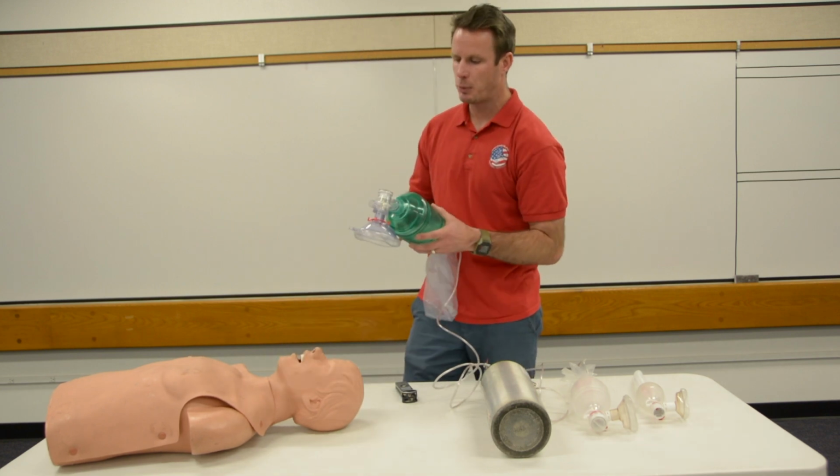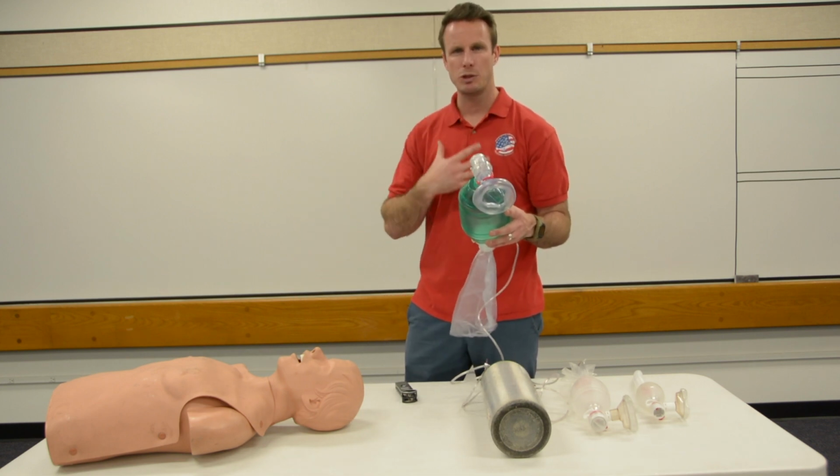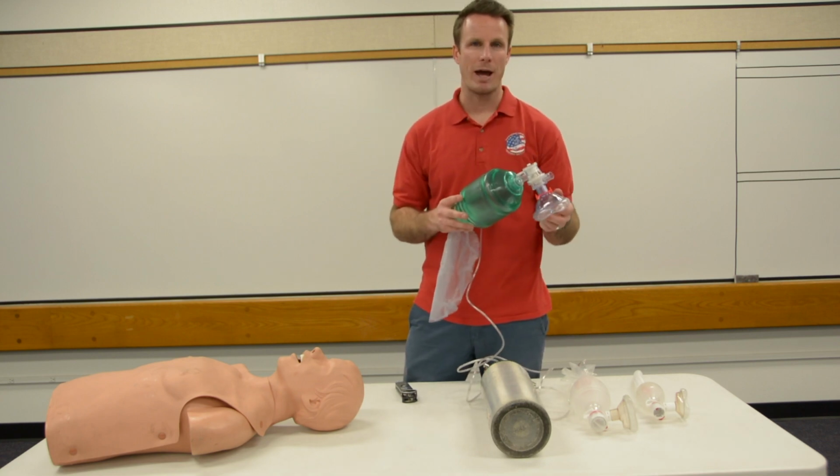And this device helps push the oxygen down into their lungs, where these other two devices don't necessarily push it down into your patient's lungs to help them breathe. So that is the benefit of your BVM, or bag valve mask.